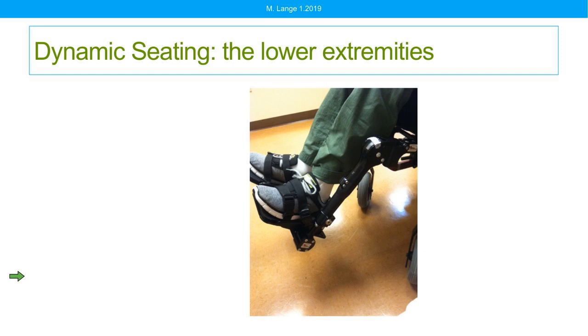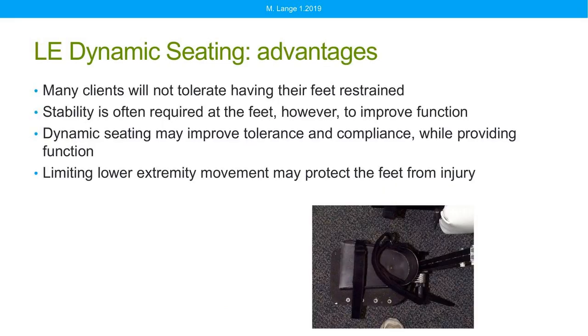All right, so we're going to move on, and then I will continue answering questions at our next little break here. So let's talk about dynamic seating at the lower extremities.